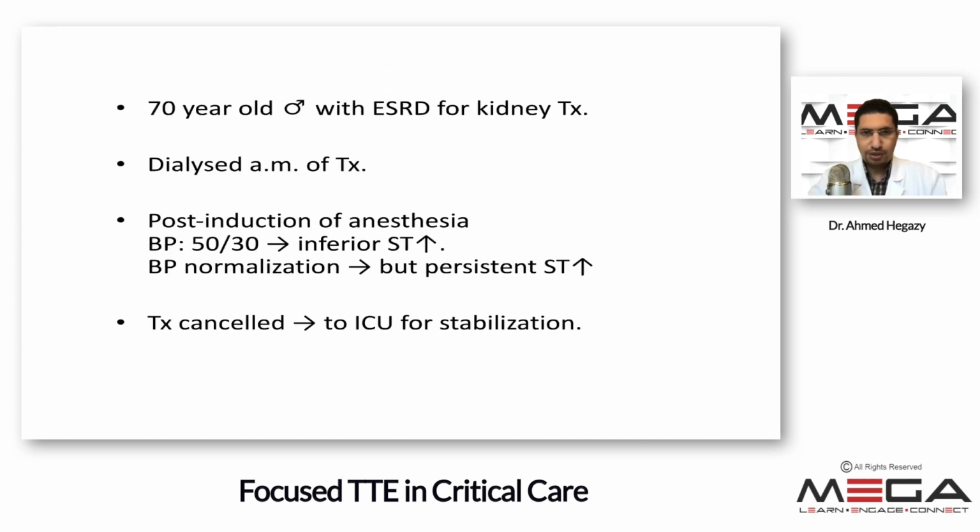All right, let's go through some clinical vignettes now. So these are real cases that I have used ultrasound in, and it actually has made a difference in patient management and in patient trajectory and course. And so our first patient here is a 70-year-old gentleman with end-stage renal disease presenting for a kidney transplant. And he got his dialysis session on the morning of getting his kidney transplant. And right after induction of anesthesia, the blood pressure dropped to 50 over 30.